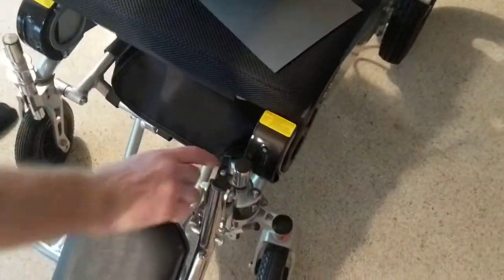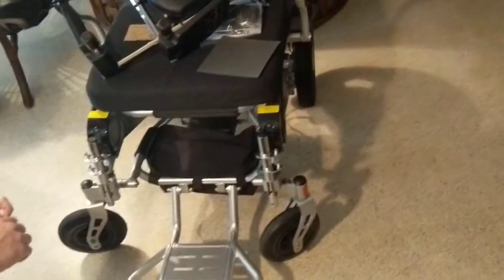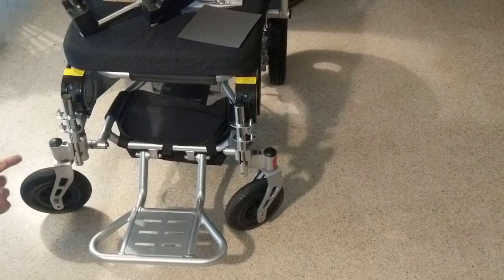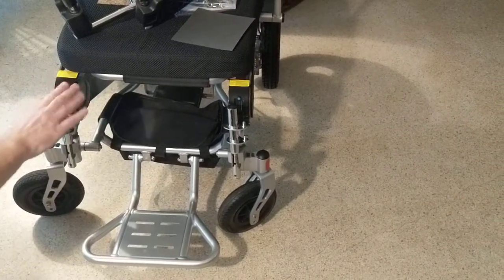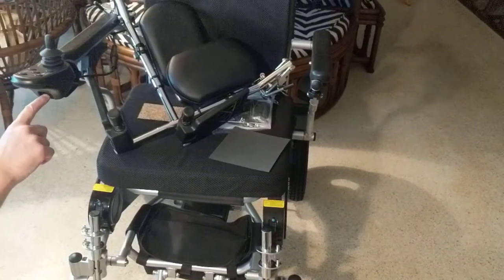When you want to get the leg rest off, I just open this latch, they swing out, and they just lift up. I can easily take both leg rests off the chair. If I want to fold the chair up at that point I can. These posts will allow me to attach the leg rests or take them off as I please.